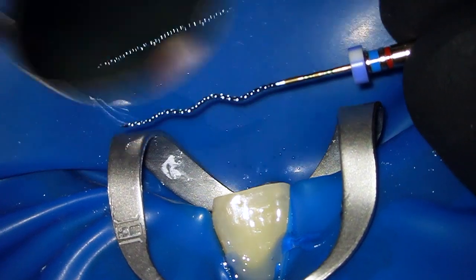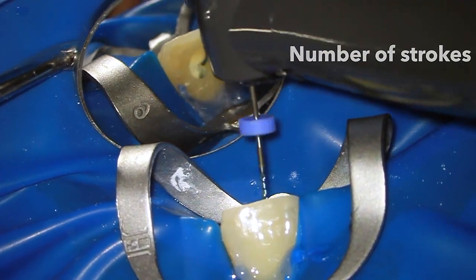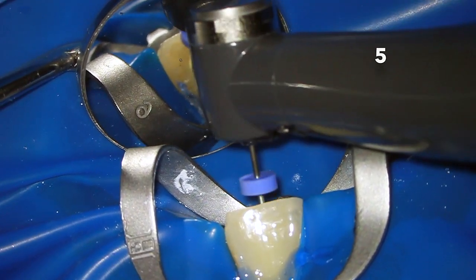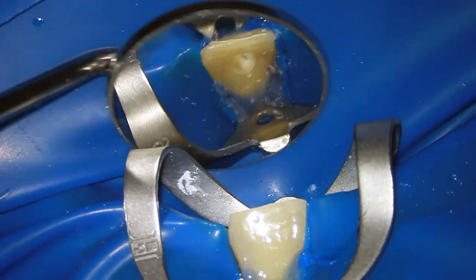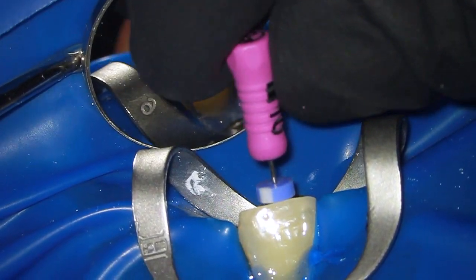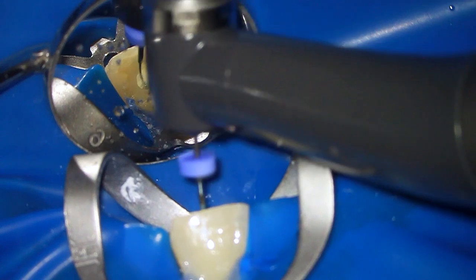Now we are ready to use the XP Endo Rise shaper. Remember that 8 long gentle strokes should be used. Recapitulate again. Now we can use the finisher to clean the root canal space properly. Remember about long gentle strokes of 7-8 mm that should be used for 1 minute.